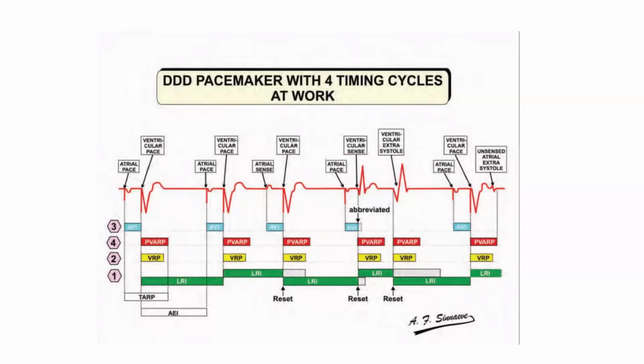The pacemaker acts at the lower rate you programmed, like 60 beats per minute, only if it's pacing both atrium and ventricle. But remember, the main order you give the pacemaker is to follow the atrium, to regain the patient his sinus control of his rhythm. So if the sinus node increases its rate, it will increase the heart rate. Decrease rate, it will decrease the heart rate. And you don't allow it to decrease below a fixed point like 60 beats per minute. But if you have a normal sinus node function with fast P waves, the pacemaker will follow these waves.